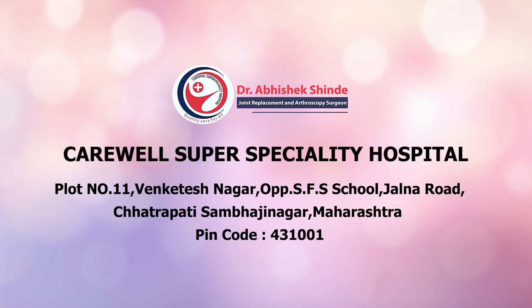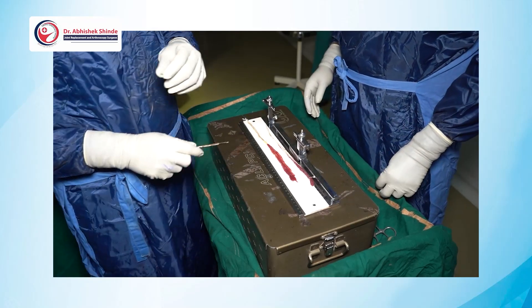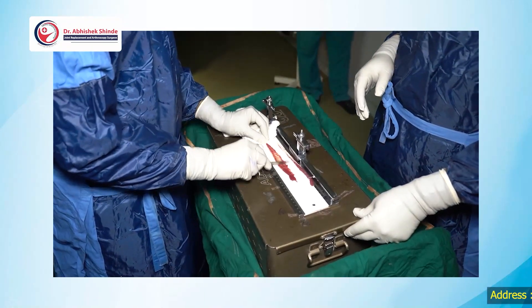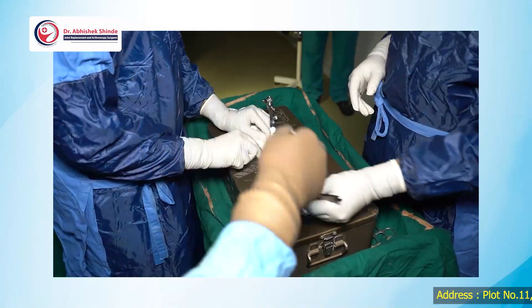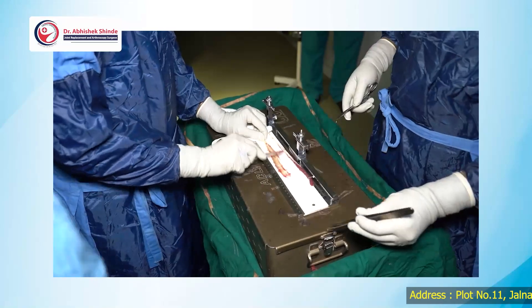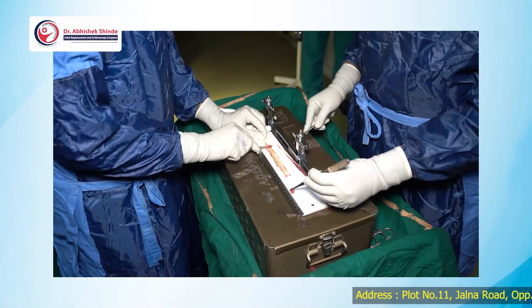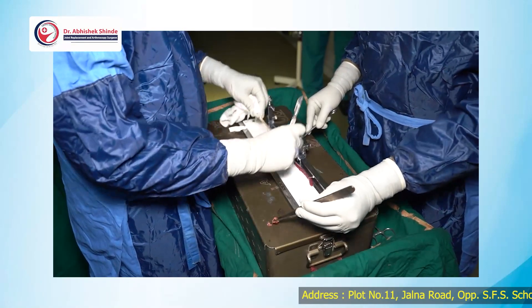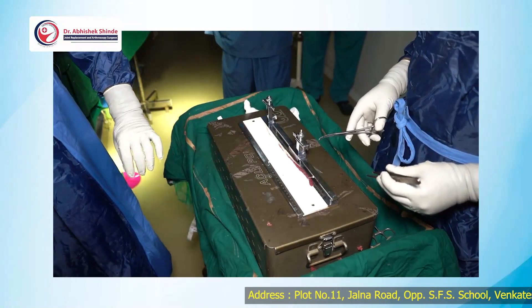Hello friends. Today I am going to demonstrate how to prepare the graft for ACL or PCL reconstruction. This is a simple method but you have to follow some particular steps. This is the semitendinosus and gracilis which we are going to prepare for ACL reconstruction, which I have previously demonstrated on my YouTube channel.